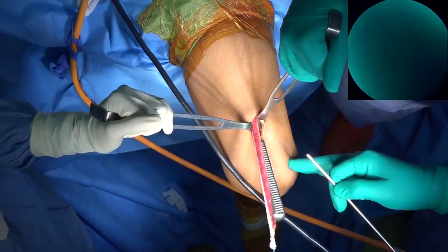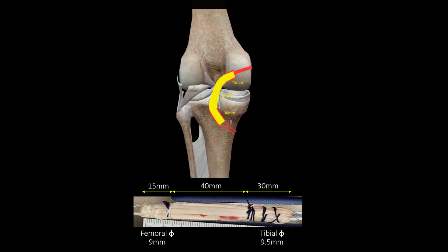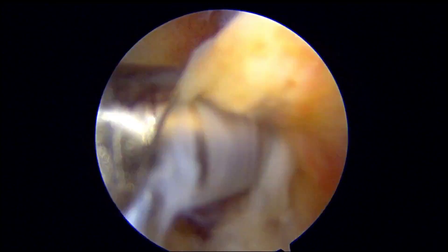A quadruplet graft with an expected length of 85 millimeters was created from this obtained quadriceps graft. The diameter of the femoral portion of this graft is 9 mm, while the diameter of the tibial portion is 9.5 mm. The design for graft implantation involves embedding the graft 15 millimeters into the femoral tunnel, with an intra-articular length of 40 millimeters and 30 millimeters into the tibial tunnel. Adjustable buttons were attached to both ends of the graft, with additional augmentation using internal brace tape passed through the femoral button. Standard anterolateral and anteromedial portals were created.